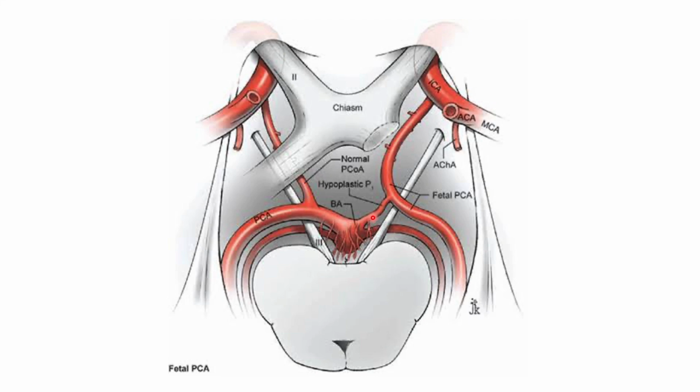This is a very hypoplastic connection, and this is called a fetal PCA when you have a dominant PCOM from the ICA actually forming the complete PCA. This connection could be hypoplastic, or there could be no communication with the basilar at all, and the artery may come straight from the ICA with no connection with the basilar here.